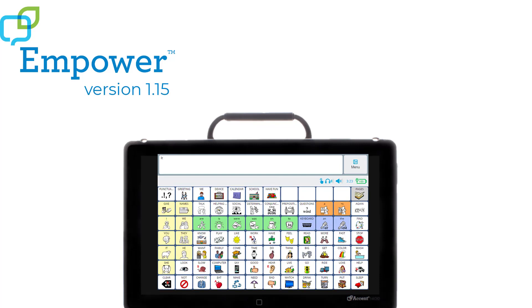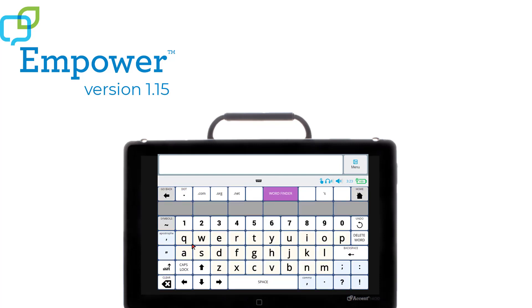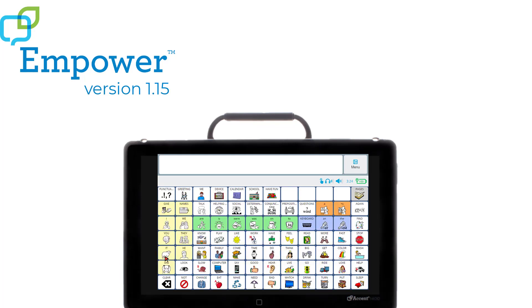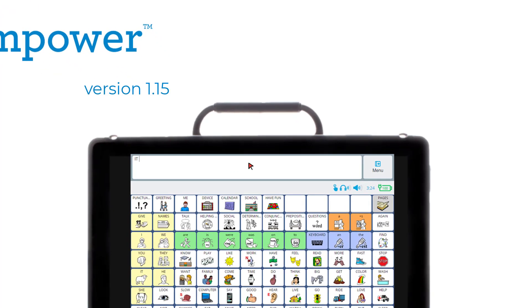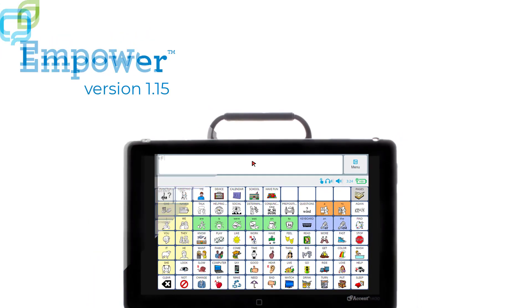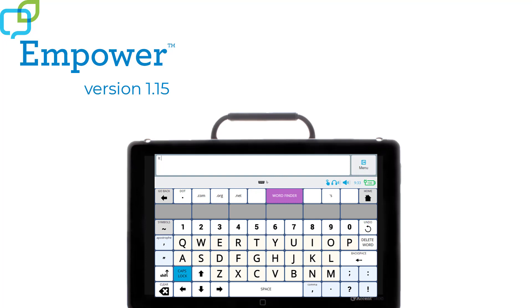Let's turn on the caps lock. I'll go to my keyboard and select caps lock. I can tell caps lock is turned on because the button turns blue. Now, back in my vocabulary, when I select the word 'it', you'll see that both letters are capitalized in the message window. This means when spoken from the message window, you will hear 'IT' instead of the word 'it'. By going back to the keyboard and turning the caps lock off, you can change this.